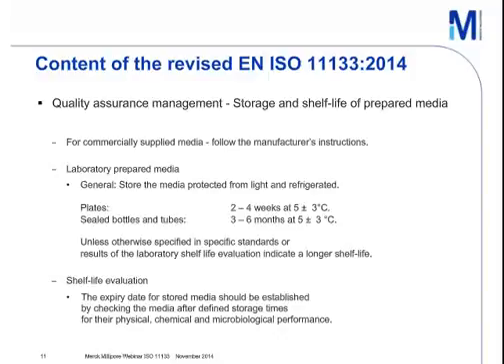Also, information is given on how to conduct a shelf life evaluation. The expiry date for stored media should be established by checking the media after defined storage times for their physical, chemical and microbiological performance.